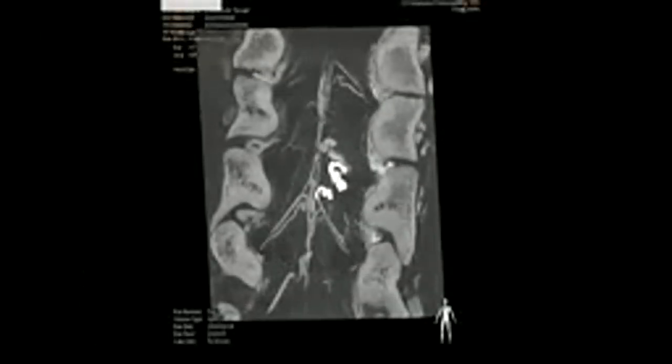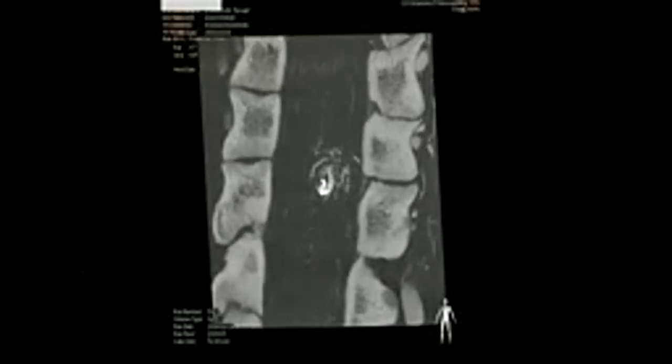This is the nidus. This is not a fistula. This is the nidus. From time to time, it is mixing. Which one is nidus? Which one is fistula? And then our microcatheter is there. And then we have a partial embolization, not forcing our chance and the patient's chance too much to have a total occlusion in that group.